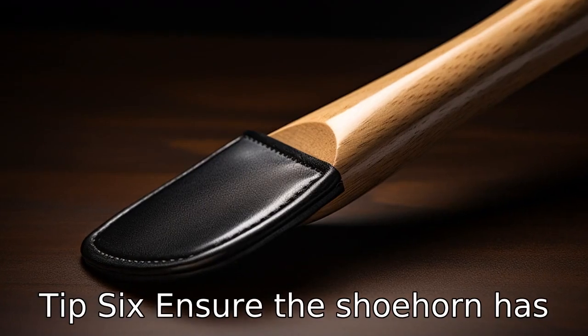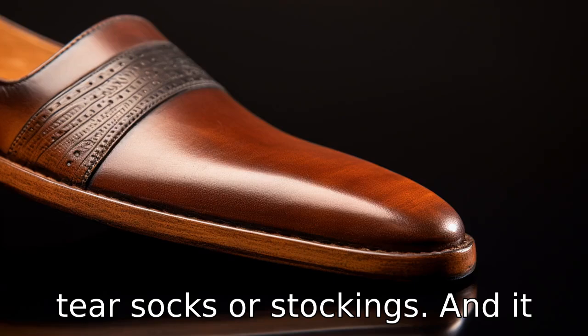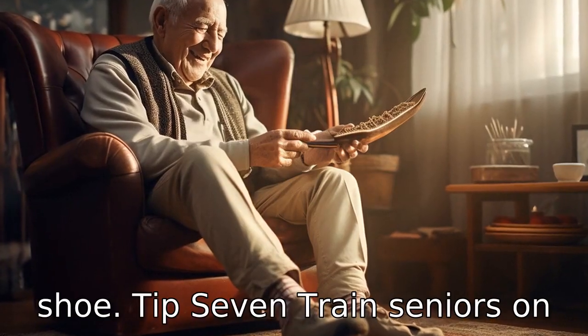Tip 6. Ensure the shoehorn has a smooth edge. A shoehorn with a smooth edge will not snag or tear socks or stockings, and it will slide easily inside the shoe.